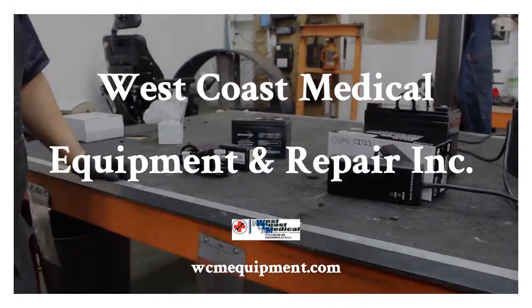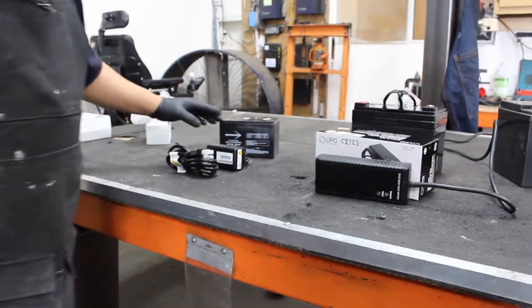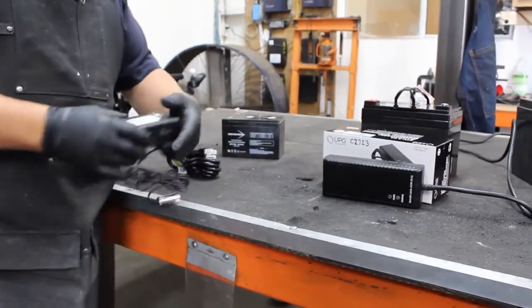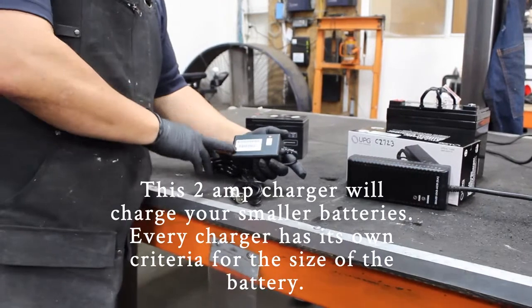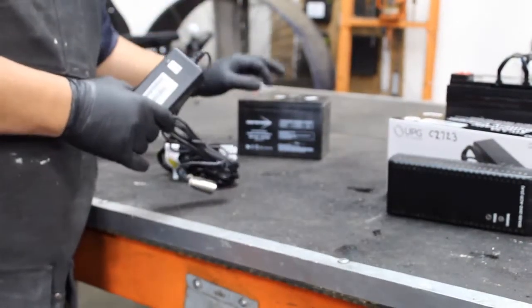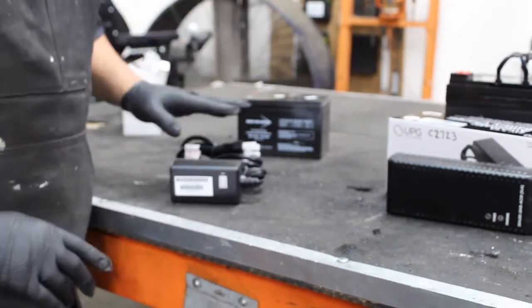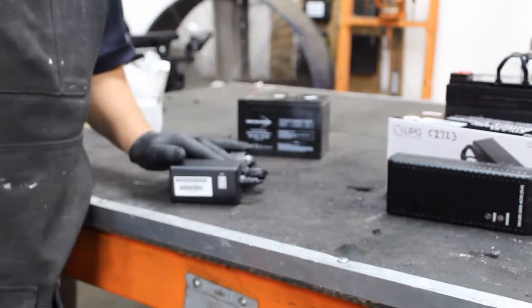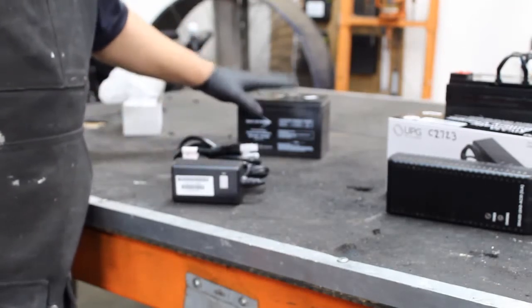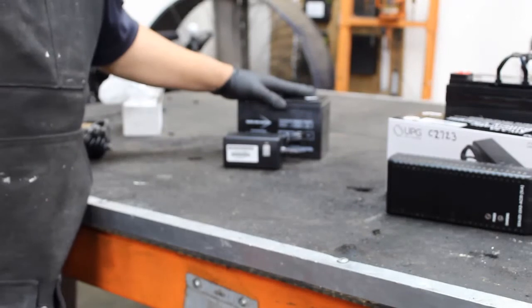Today we're going to talk about chargers. There are three styles of chargers that we carry in here. The very small one is a 2A charger. This 2A charger is just that — it charges very, very slowly. I can charge this on any battery that I have that I'm going to show you, but this is meant for this type of battery. It's a 2A charger and it charges very slowly.